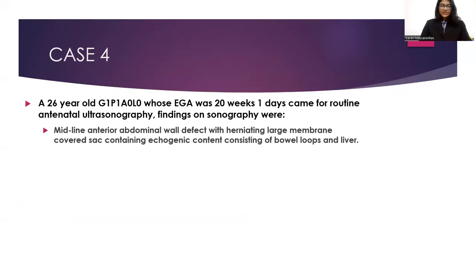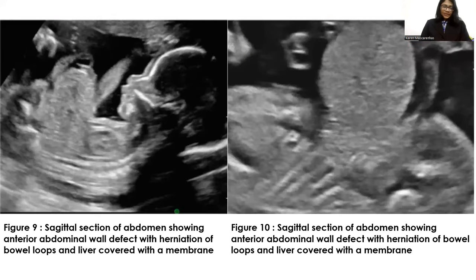My fourth case: a 26-year-old G1P1A0L0 with an estimated gestational age of 20 weeks and 1 day came for routine antenatal ultrasonography. Findings on sonography were a midline anterior abdominal wall defect with a herniating large membrane-covered sac containing bowel loops and liver. Images show a sagittal section of the abdomen demonstrating the anterior abdominal wall defect with herniation of bowel loops and liver, with the umbilical cord attached to the sac.